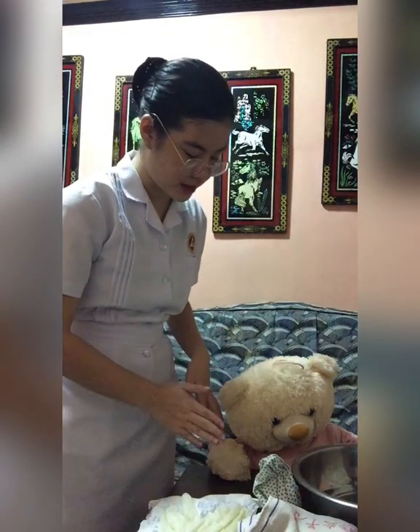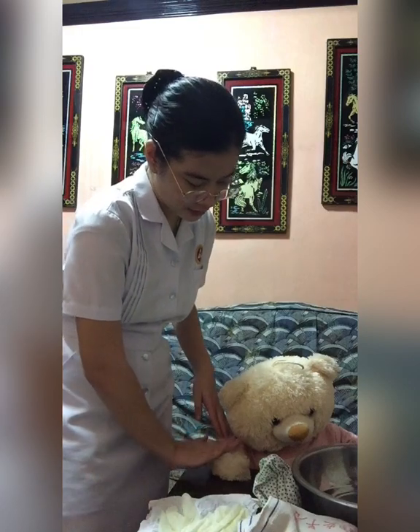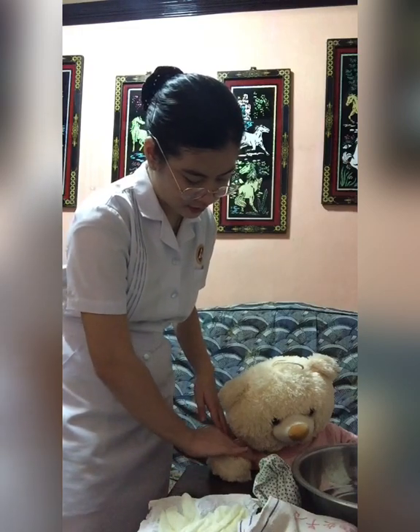And then next, perform hand hygiene and inspect the condition of the affected part, and then palpate the area for edema. So ma'am, I'm going to palpate the injured part. And then next, consider the time elapsed since the injury has occurred. So if it is more than 48 hours already, we can suggest heat therapy to the patient. So if it is not, we will go on with the cold therapy.